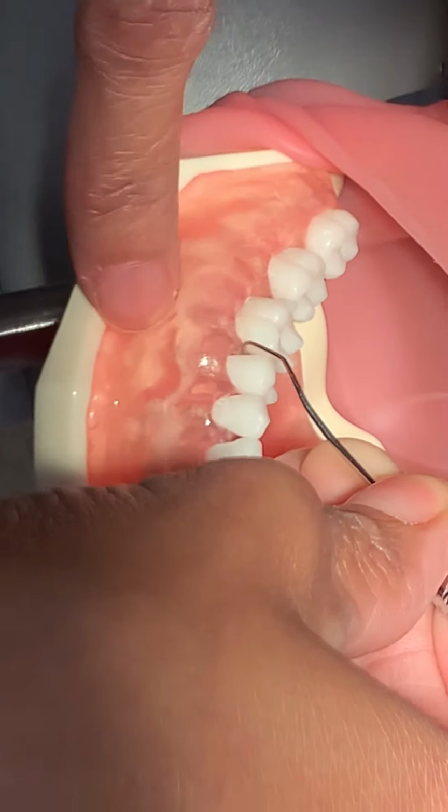If you come here, your handle is going to be coming out of the patient's mouth. So the handle is coming out parallel. The terminal shank is parallel. You see how I'm also up on my fulcrum. That's the first thing you want to do: establish a fulcrum. Because if you don't establish a fulcrum, the terminal shank can be in there like that. It can be either way. So you want to first establish your fulcrum, and this is where you have to talk about me, my patient, my equipment, and all that we talked about on Friday, and then your finger rest or your fulcrum. If you establish your fulcrum, being up on your fulcrum, this is your terminal shank and it's parallel.